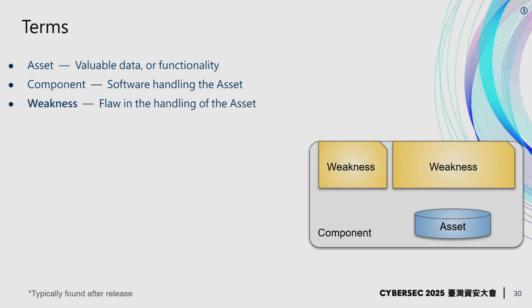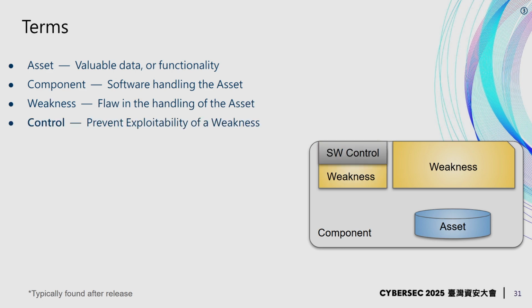Your software will eventually have some bugs or design issues, what we call flaws. It won't be perfect. So you will try, through the risk activity, to find those weaknesses and resolve them with controls, right? That way you have resolved the weaknesses and your software will not have them. But you might miss some of them if you don't do the right risk identification.